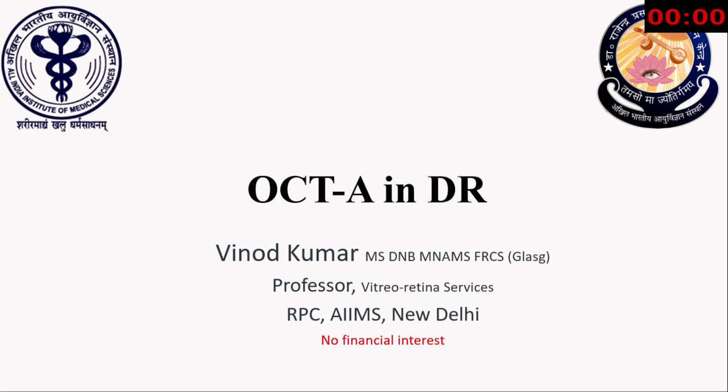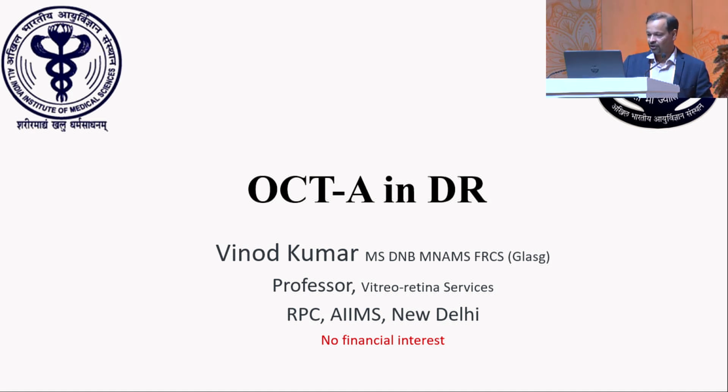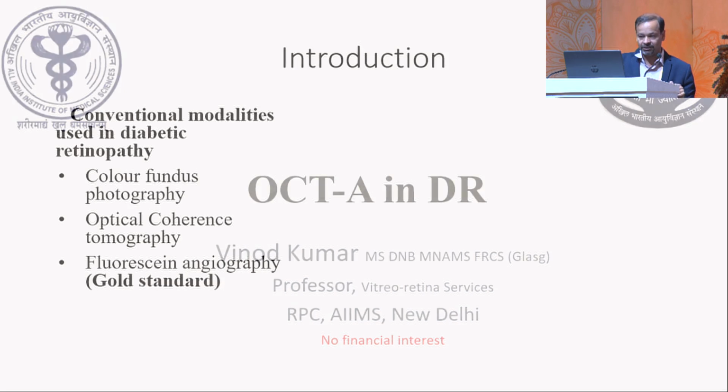Over to you, sir. Good morning. So I'll be talking about OCTA in vascular pathologies, and mainly I'll talk about diabetic retinopathy. At the outset, I'd like to thank Ankur for having me in this course.